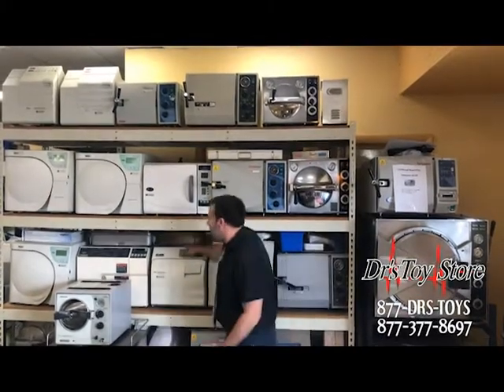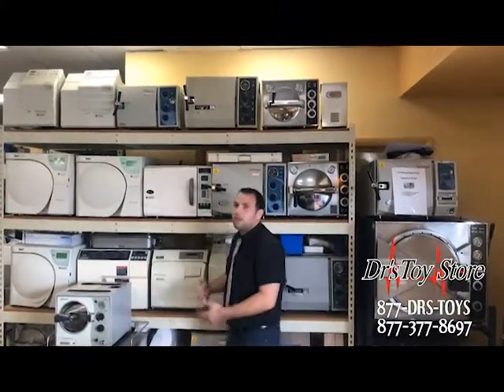Then we have the M9s which are very good autoclaves. They have everything fully automatic. You don't need to worry. Sit back, press a button and go to work.